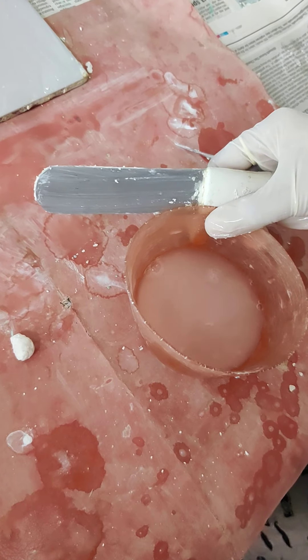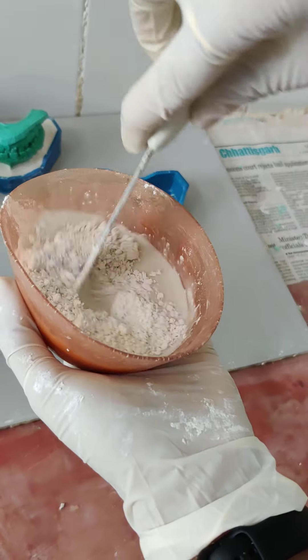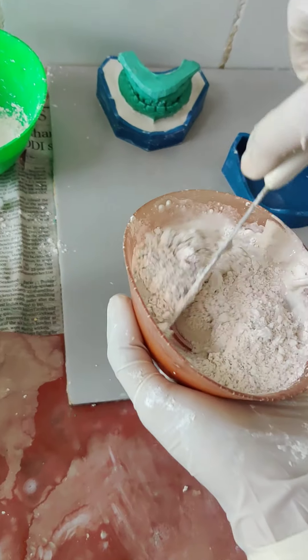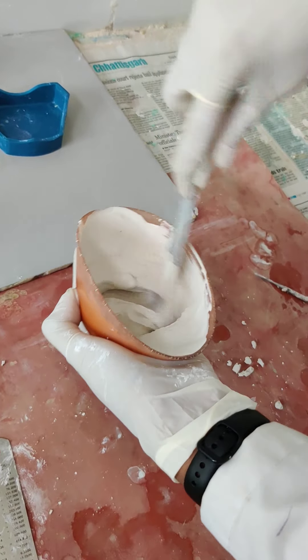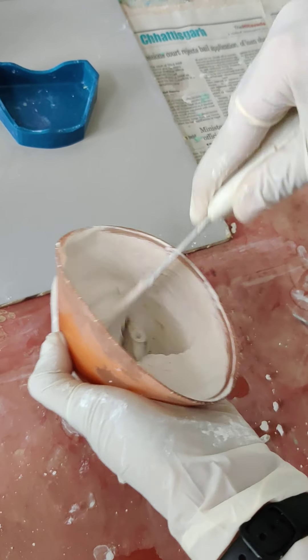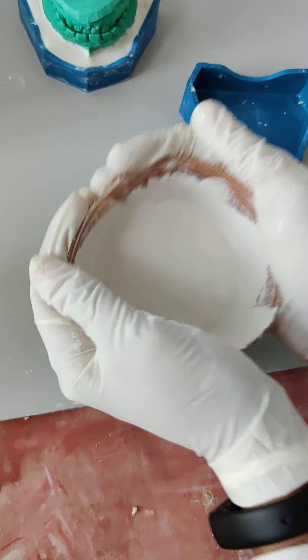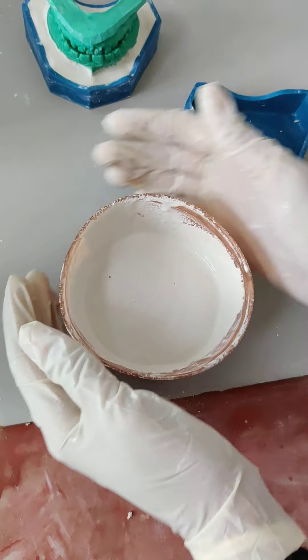We will start mixing the plaster for making the mandibular cast base. Mix the plaster very vigorously to avoid forming lumps. Tap the final plaster so that any air bubbles rise to the surface, then remove any impurities or air bubbles.